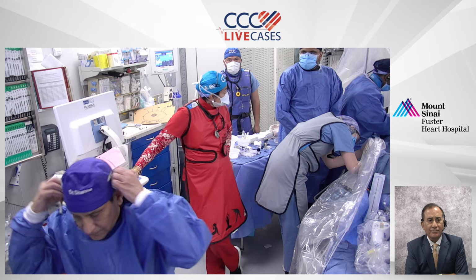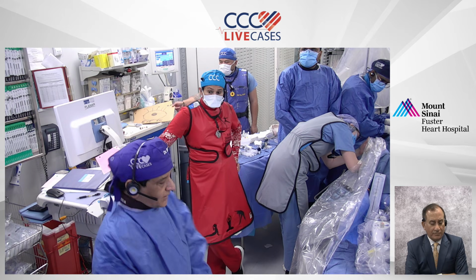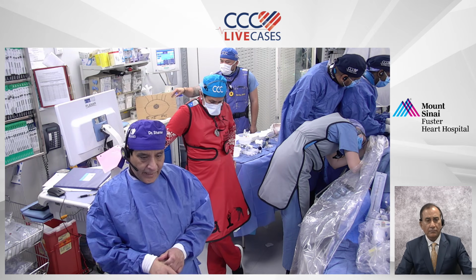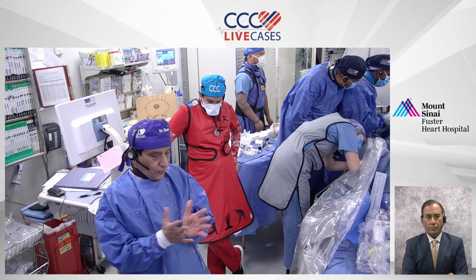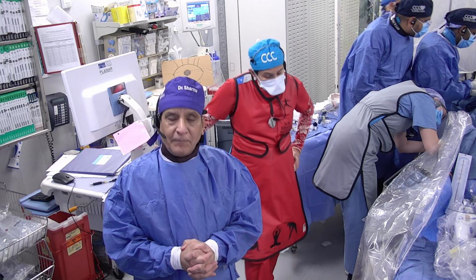Yeah, so this is the every month event which we have been doing, but then once a year, we put 9-10 complex cases together, and our focus is calcific lesions. Of course, the left main bifurcations and calcific lesions, some with the Impella support.